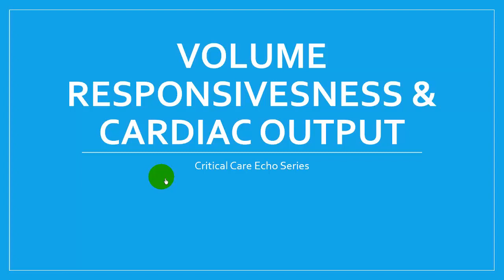ultrasound. Now, I'm going to spend about 15-20 minutes here telling you why IVC ultrasound is actually very unhelpful in many ICU patients. But for some patients, it is helpful, and it's also a good opportunity to review the venous return physiology before we talk about some other ways of measuring volume responsiveness and cardiac output with the echo probe.